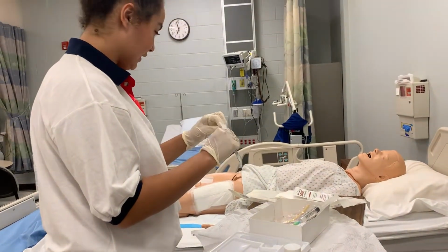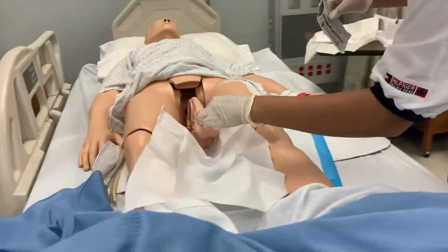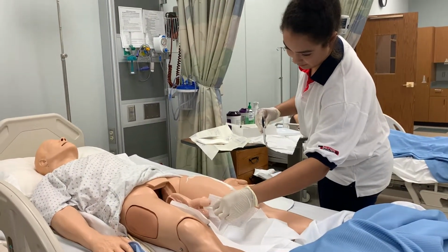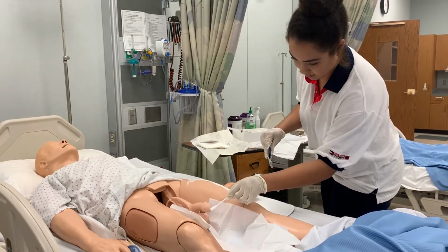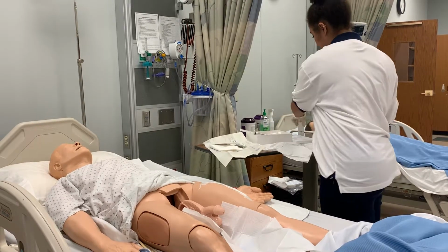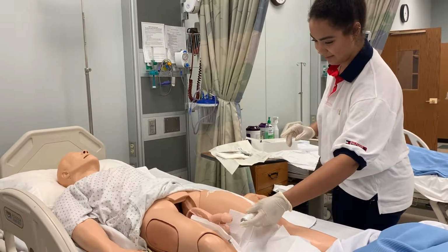Okay, now I'm going to clean this area. So I'm going to do and toss. I'm going to be tossing this, fully clean around the area and down the middle. All right, okay, I am going to grab lubricant and spray the area, which is from my sterile packaging. Yeah, that looks good.